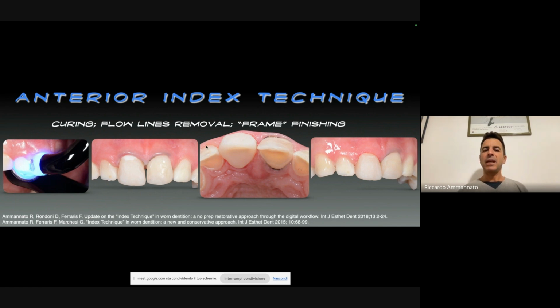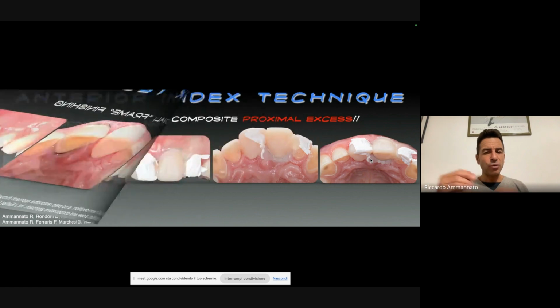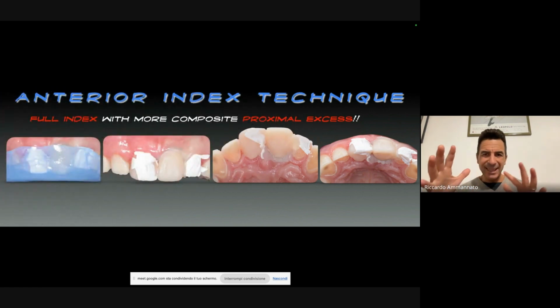This is after a quick finishing, these two images, also from the occlusal view, and this is after removing my flow lines. I usually do the flow lines with a very milky shade, because it's something that then I'm going to remove, as you see here. It's just meant to stabilize my single index, okay? So that's why I usually use a color that is completely different from the color of the tooth.